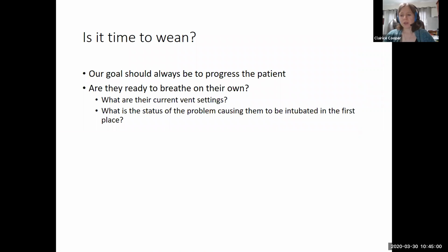So that covers patients on a full control mode, the most common being volume control, either PRVC or VCAC, along with how to make changes to the ventilator settings based on how the patient is doing and their blood gas, as well as management of very difficult patients. Hopefully, you'll see some patients improve.